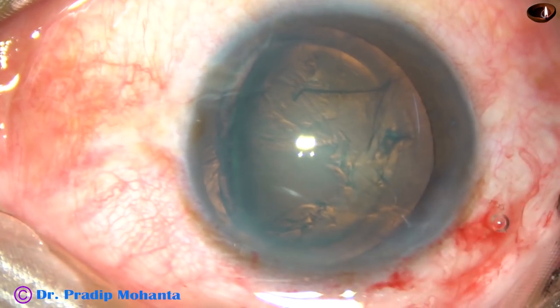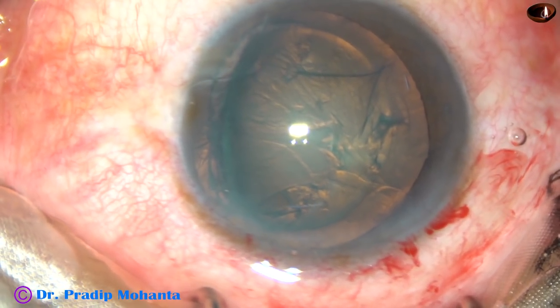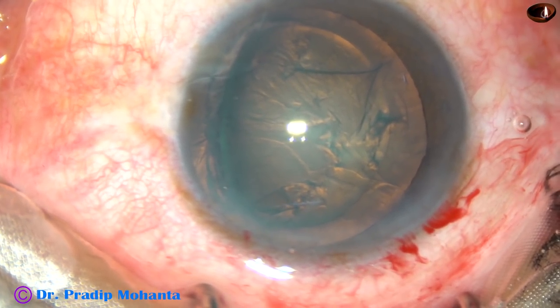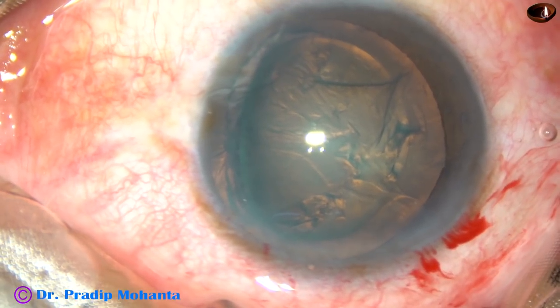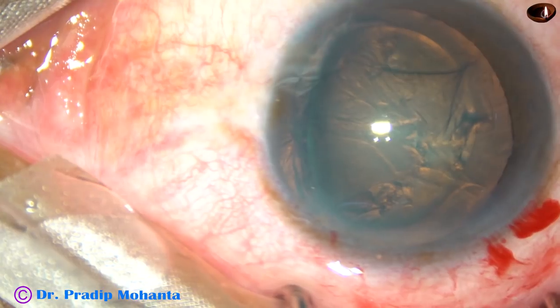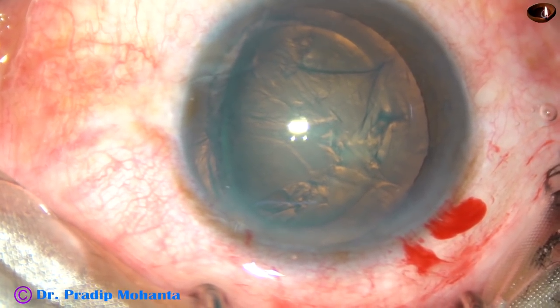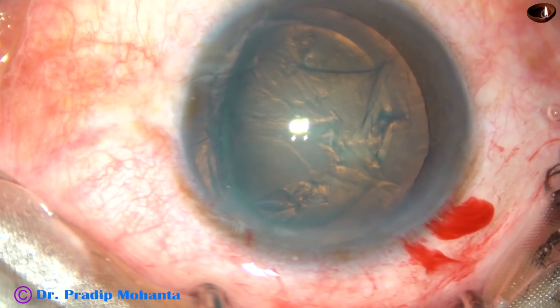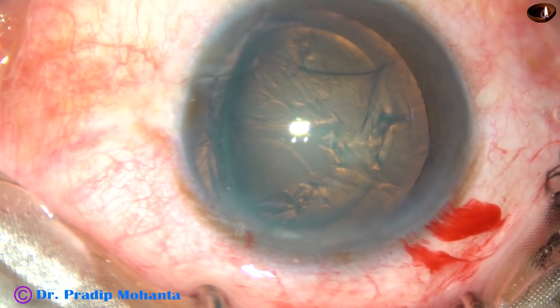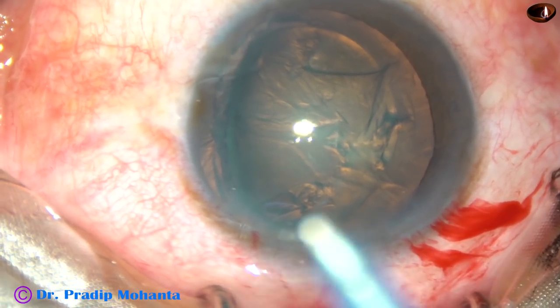Now I inject Visco. And now I take the chopper — the chopper which has been designed by me, a very small chopper known as Mohanta's Chopper. I am going to introduce that chopper through the left side port — only one side port in this case.